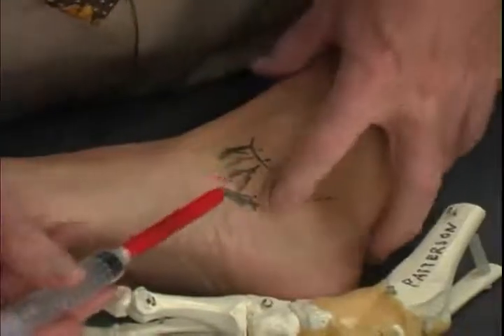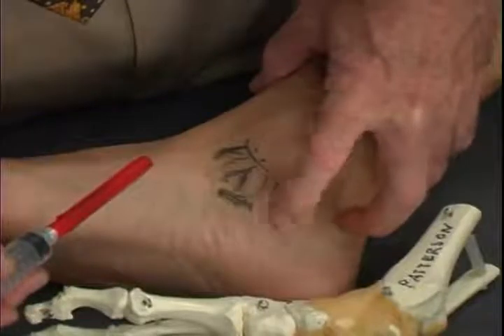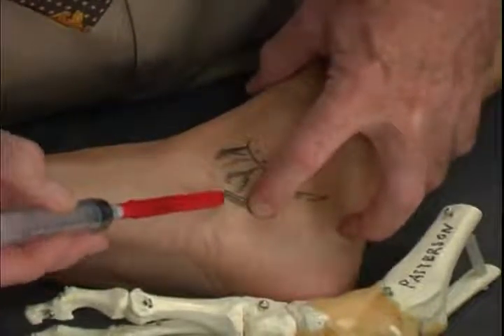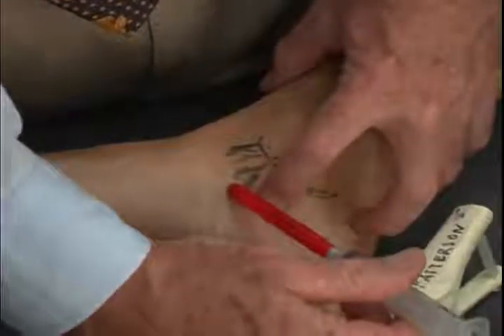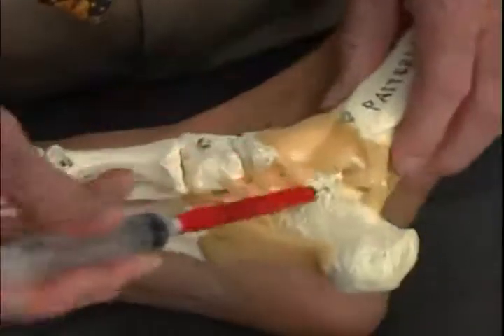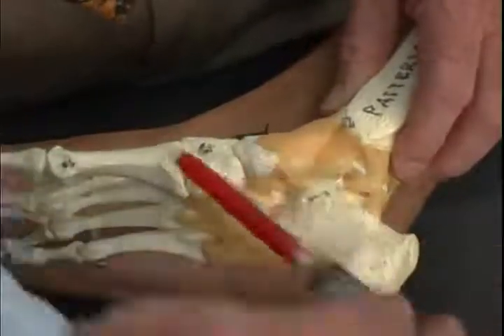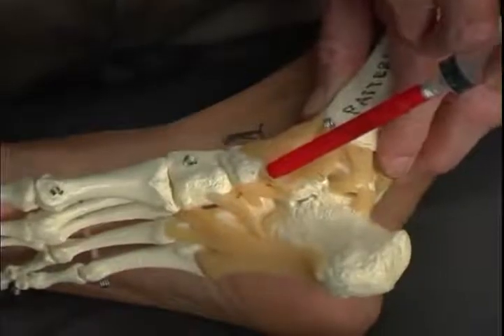We then move our attention to the spring ligament, coming again from the sustentaculum tali, little prominent bump, up to the navicular. We want to inject both ends of that on the navicular and on the sustentaculum tali. Again, in our model, looking at coming to the sustentaculum tali here, and then moving our needle up to the other end onto the navicular here.